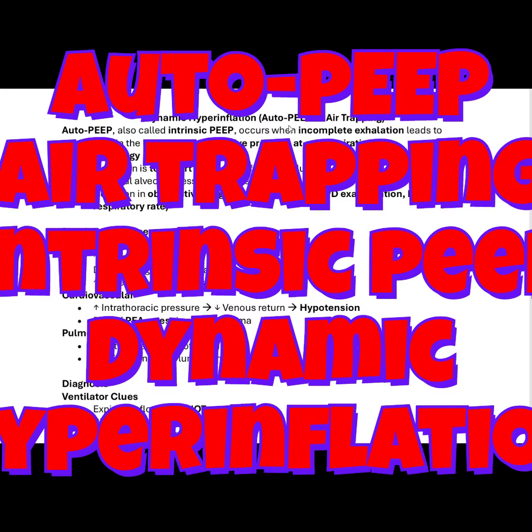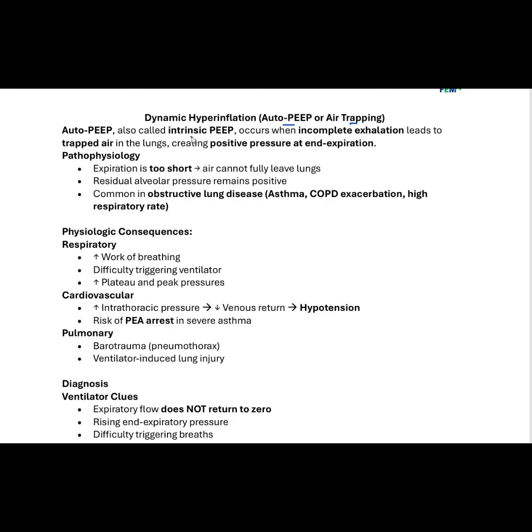Dynamic hyperinflation, which is what we call auto PEEP or air trapping. Auto PEEP is also called intrinsic PEEP. And this occurs when there's incomplete exhalation. If there's incomplete exhalation, that means there's still some gas left in the lungs at the end of exhalation. And then what's going to happen? Then the ventilator delivers another breath, before the patient finishes exhalation.